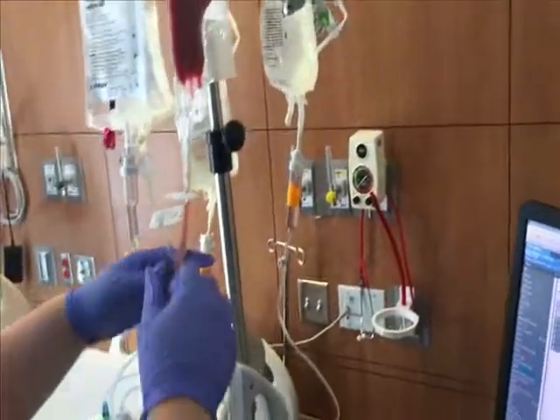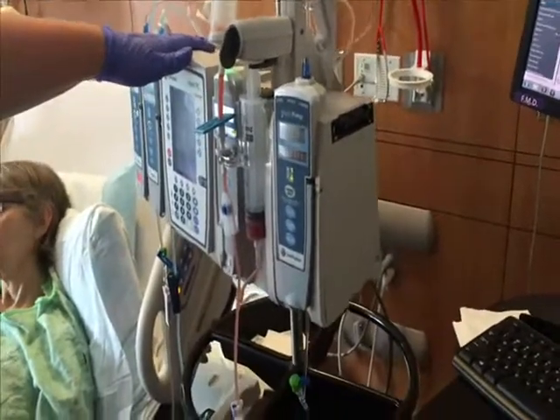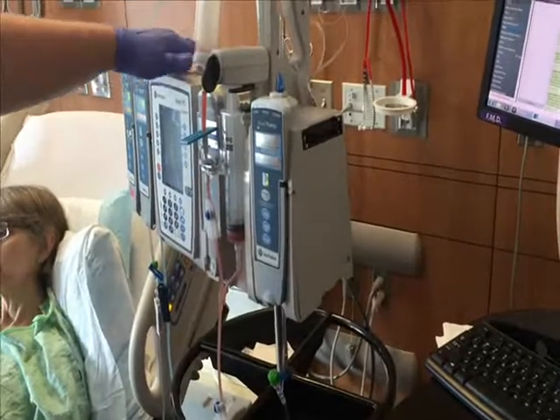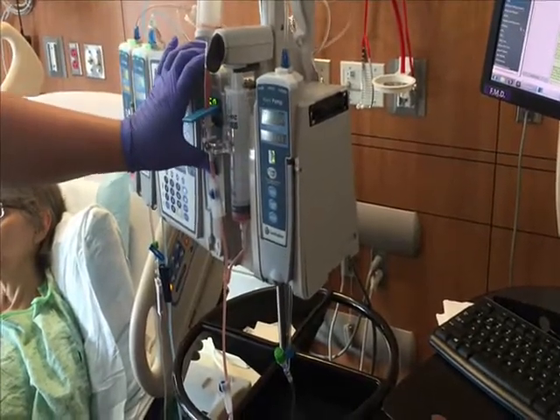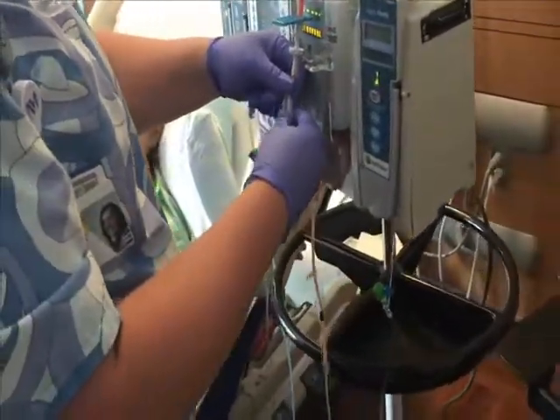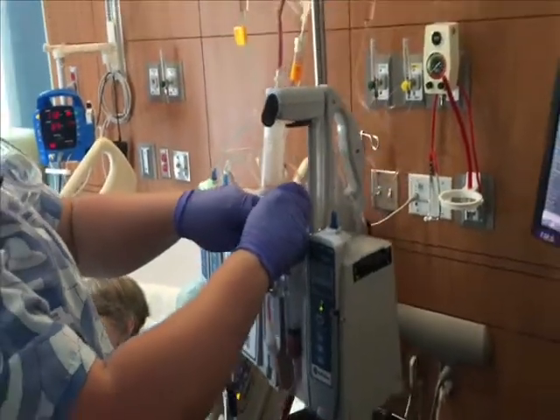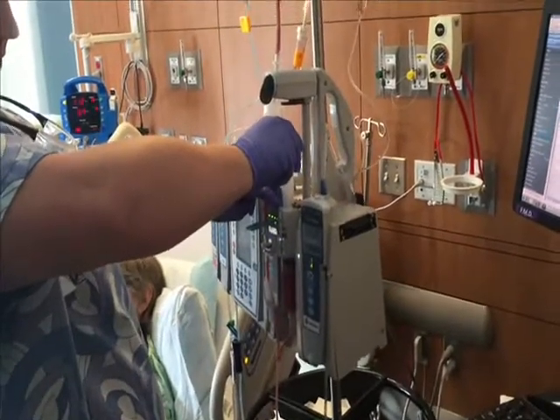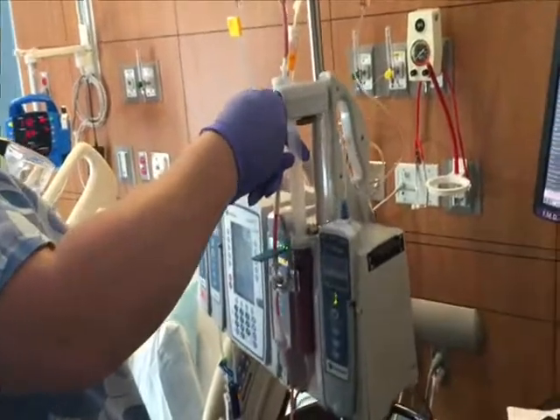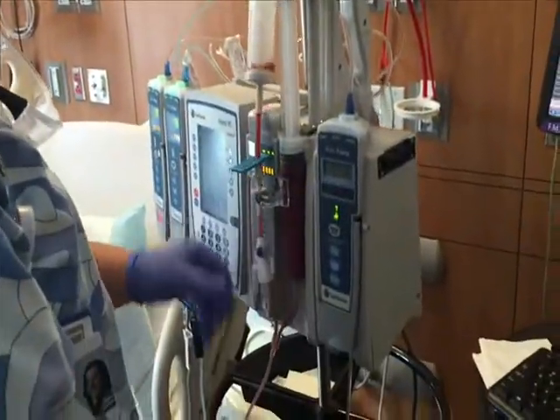So that's just water dripping from the bath. Okay. Now we just gotta wait for this guy to finish up. So you close that one, you open that one, open this guy, you open that one. There it goes. Now you draw it in. And you open everything back up.